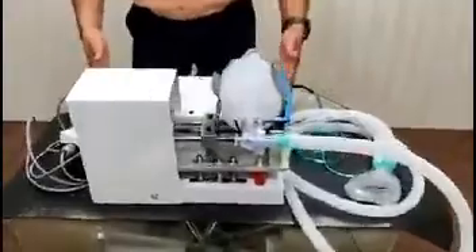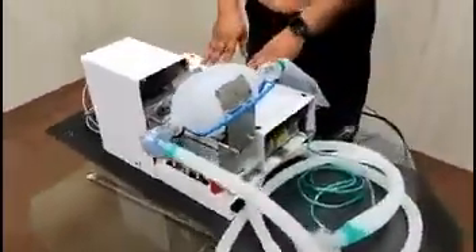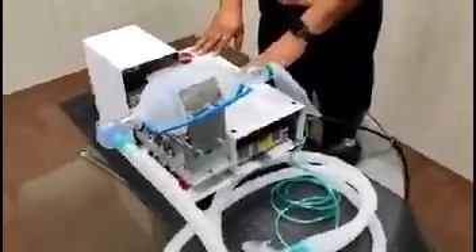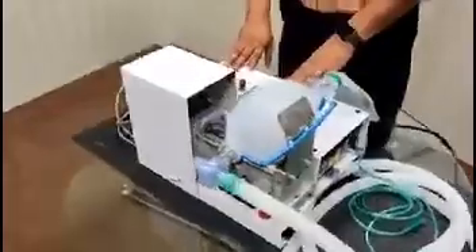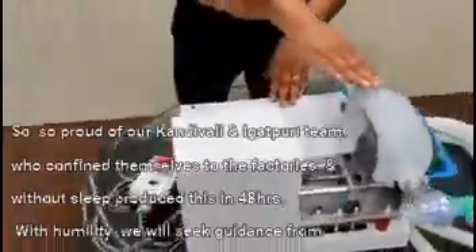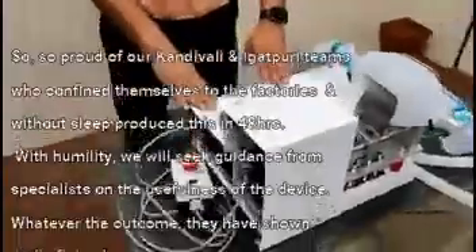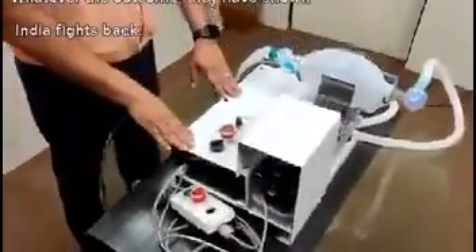There is an inbuilt logic in this device so that if the machine stops for any reason, an alarm will alert the attendant or doctor to come and attend to the patient. In that case, the BVM bag can be operated manually. To ensure reliability and durability, we have used all standard off-the-shelf parts to make this device.